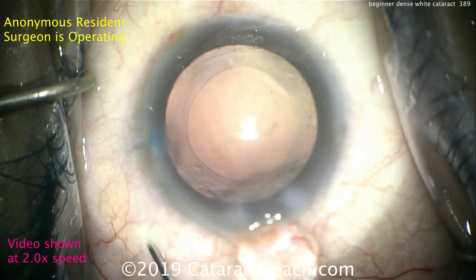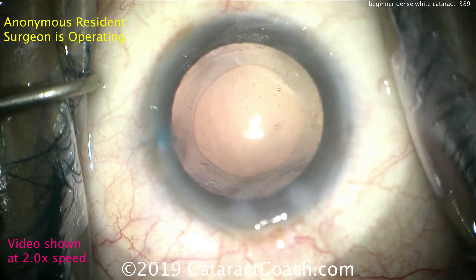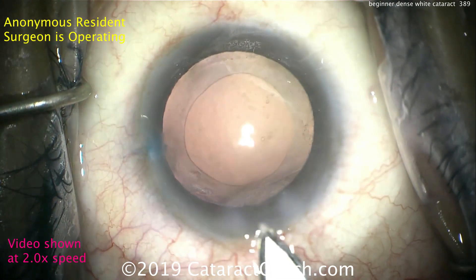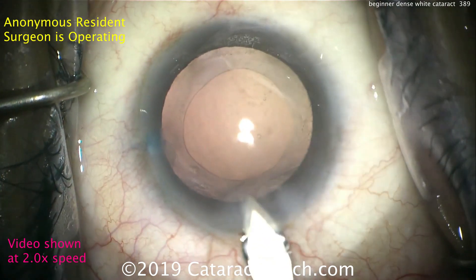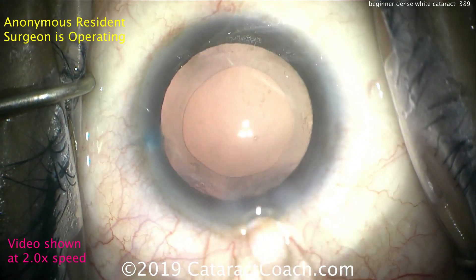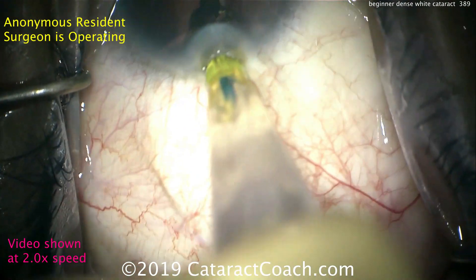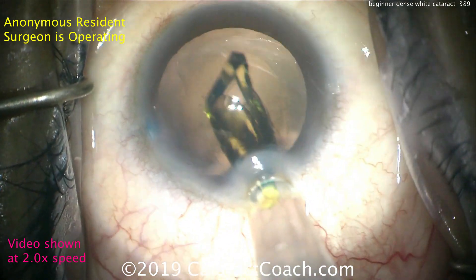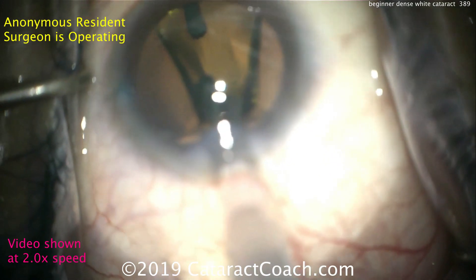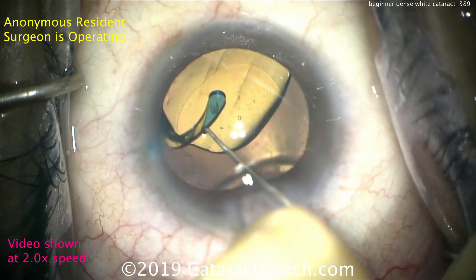Let's fill our capsular bag. There's the rexis — everything looks great. The incision is going to be slightly enlarged; there's a keratome again. You may be better off using a larger IA and phaco tip instead of enlarging the incision later — a 2.75 tip instead. Here comes the IOL being placed in the capsular bag. It looks like a single-piece acrylic lens with blue-tipped haptics. The rexis overlaps the IOL quite nicely.